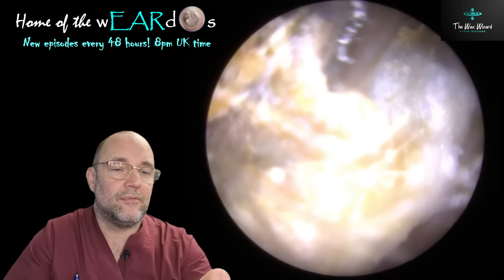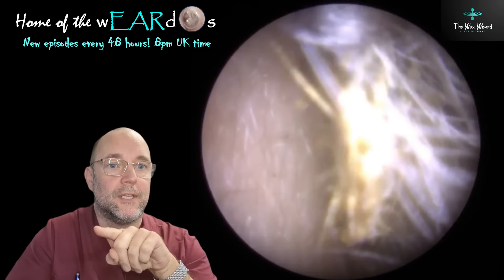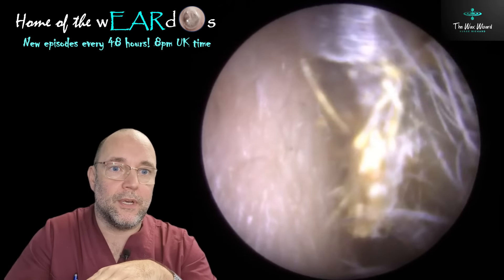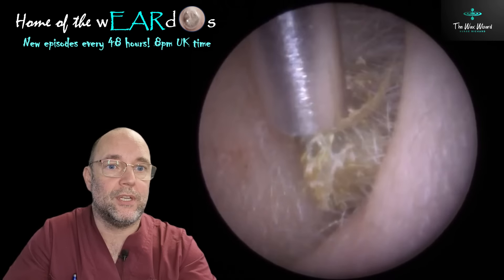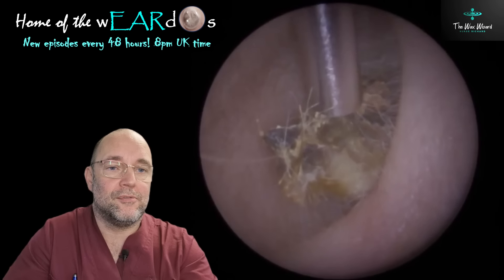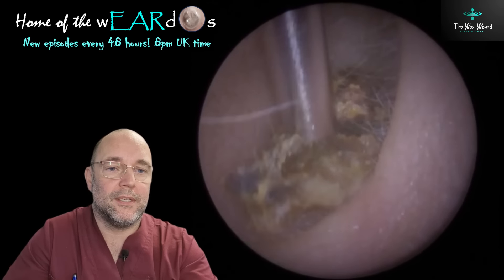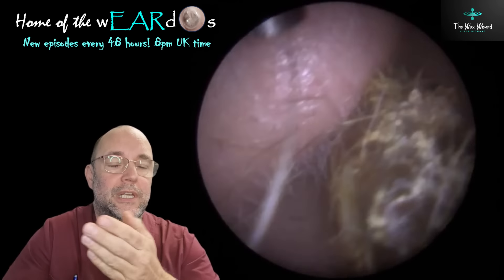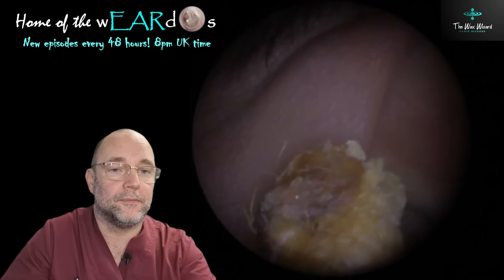You could say it's a bit like a thick metal Rosen inserter, but I found it really useful for separating this. You can see just underneath there's a thick layer of freshly shed skin just underneath that, and I suspect that's what was causing it to stick to the base of the canal wall. You'll see plenty more of that skin behind this when it comes out — and that was the faff to end all faffs trying to get the next bit out. It needed a really good shake to get this out, and you can just see already how dry and hard that is. With suction alone it wouldn't have come off really well because it was stuck, adhered to the canal wall, so using that to separate it made it much easier to pull out.